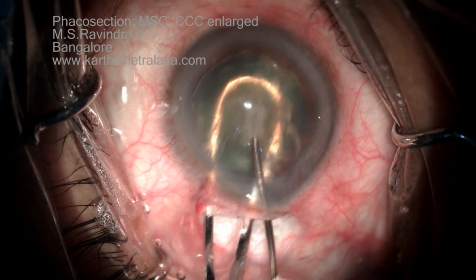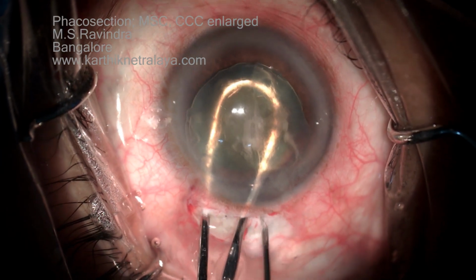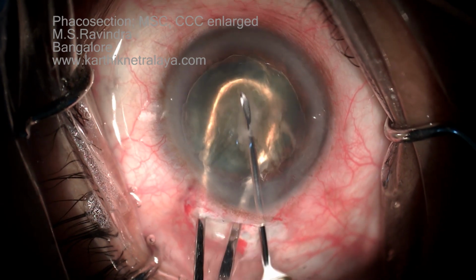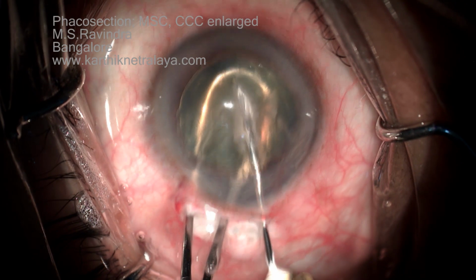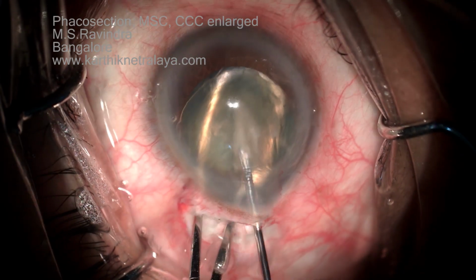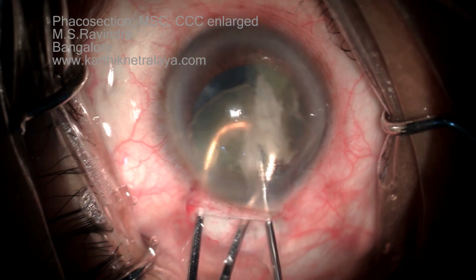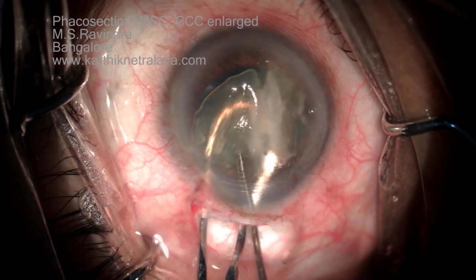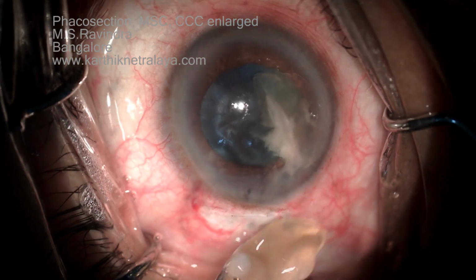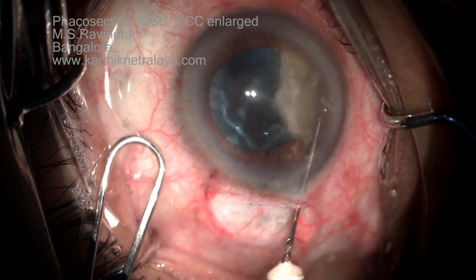It is not getting bisected. I would always divide the nucleus into two in the anterior chamber with the shaft of a cannula, but it's not happening because of the hardness. I'm scoring the nucleus with a cystotome. The cystotome is mounted on a 2 ml syringe filled with viscoelastic.